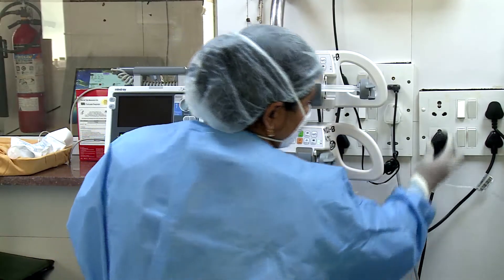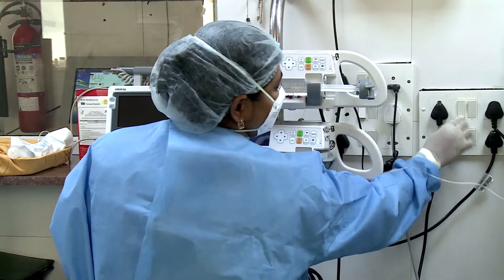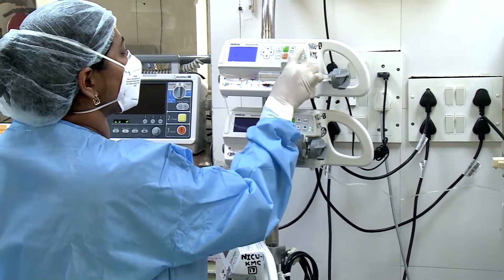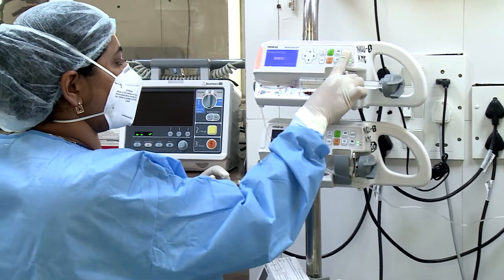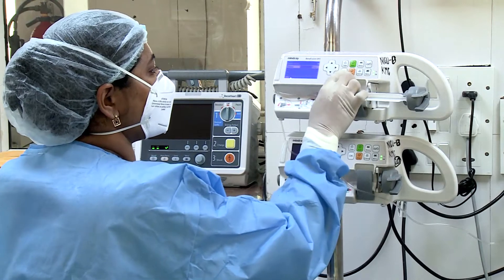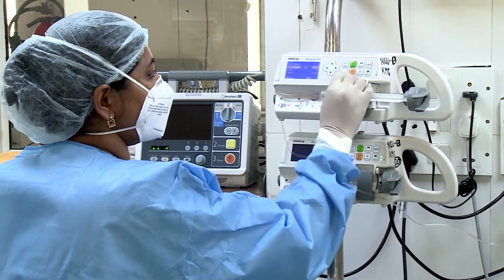Connect the power cable to the power slot and fix the infusion pump on the installation pole. Press the on button for one second to switch on the syringe pump. All the signals on the display unit will glow for a second.